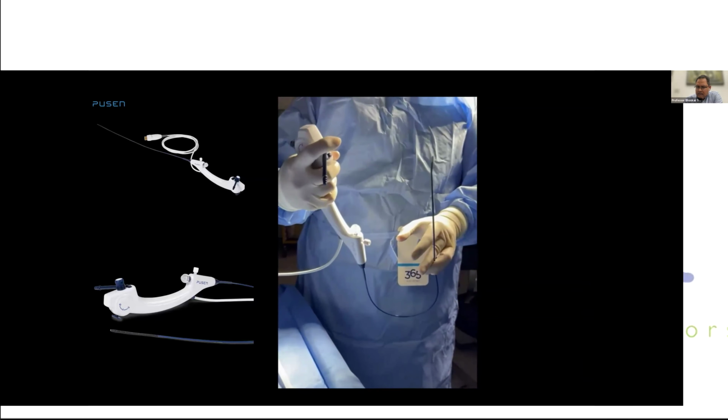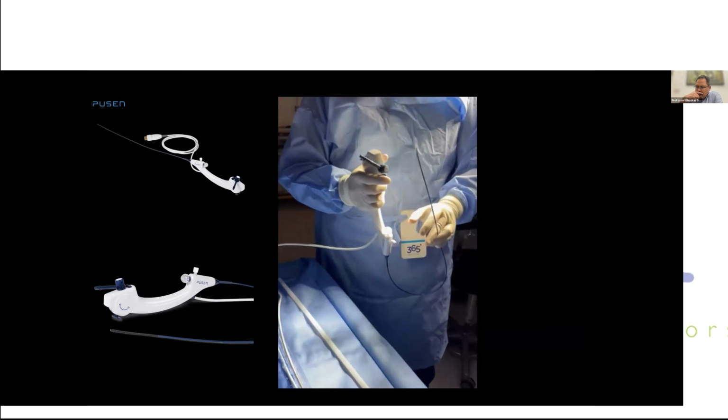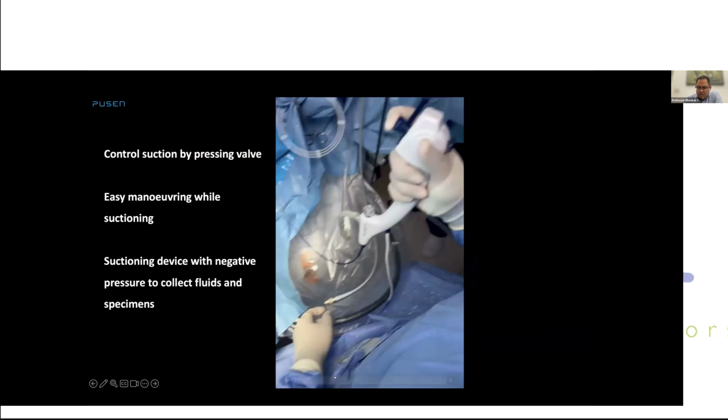And the suction is connected to the spout there, which you can see, and you can move it on either side. So it doesn't matter which side your suction is set up, you can move it to either side, and it's controlled by a finger button. I find that very, very useful because then you are in charge and you can suck as much or as little as you want. So the main advantage, apart from what Joe has said about single-use scopes, is actually the integrated suction system that helps you to manage and maneuver a little bit better when you're operating, and I'll show some videos of that.